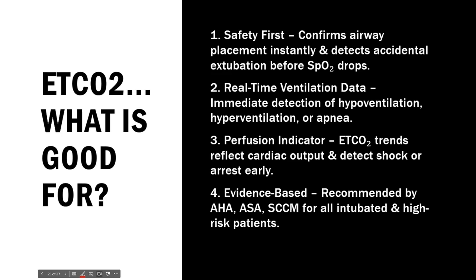But what it's also telling us is it can confirm our airway for us, because if you're trying to differentiate, is my ET tube in the esophagus or is my ET tube in the trachea, there should be no CO2 inside of the belly. Now, you can have some if you've been bagging the patient before you intubate them. Sometimes you can force air and CO2 into the stomach. That's why those colorimetric end-tidal detectors aren't the best.